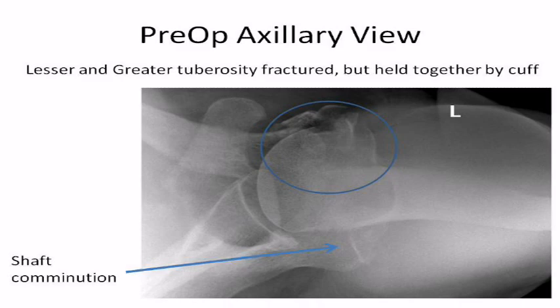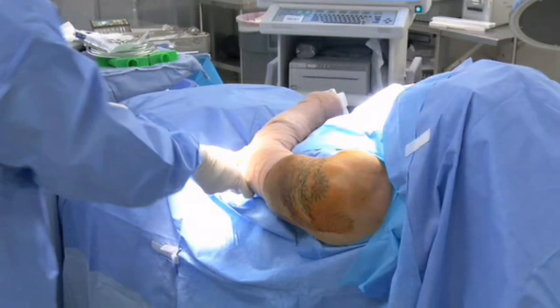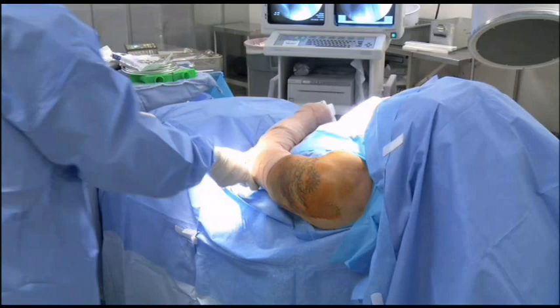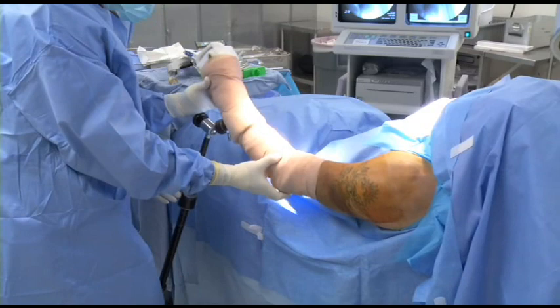The surgery is performed in the modified beach chair position, with shoulder draped free and the shoulder support removed to provide radiolucency. The C-arm is brought in from the opposite side of the table. True AP and scapular Y radiographs can be obtained with this setup to ensure adequate reduction and placement of fixation in orthogonal planes. An arm holder is going to keep the arm in more or less neutral rotation throughout the procedure.